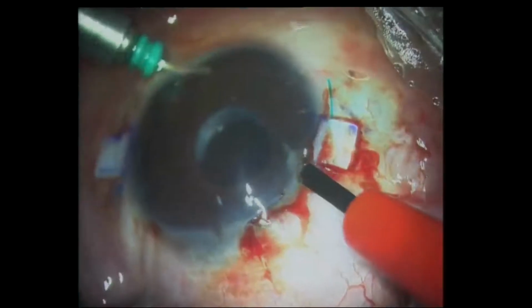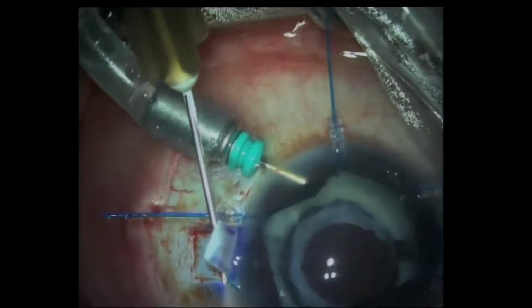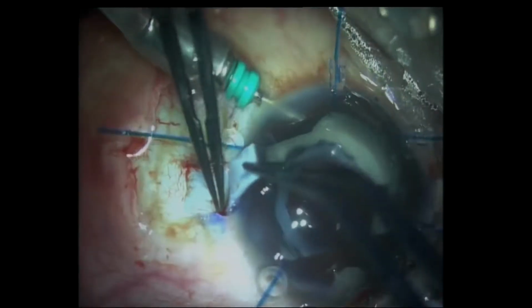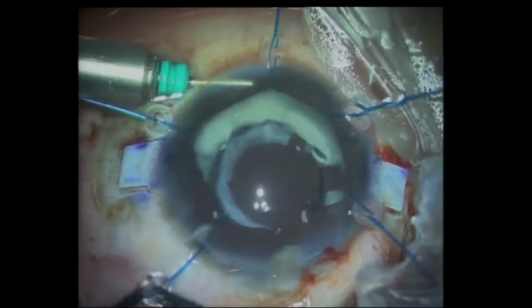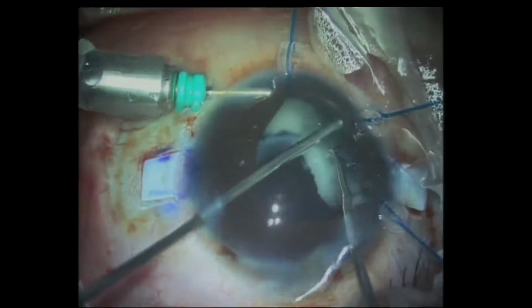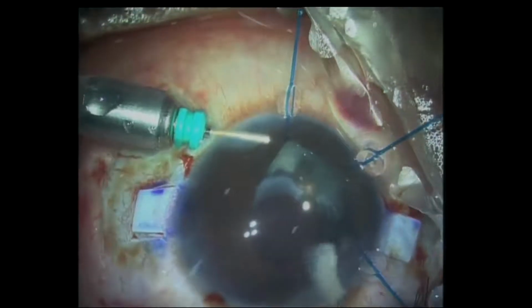Using a handshake technique, externalize the two haptics, but invariably what happens in these cases is the pupil shuts down. And once the pupil shuts down, you can't actually see the Soemmering ring. So what I started to do in these cases is quadrant by quadrant. After first stabilizing the lens, I remove two iris hooks, use those iris hook ports as two entry points to segmentalize this Soemmering ring quadrant by quadrant, bring it into the anterior chamber and burp it out.